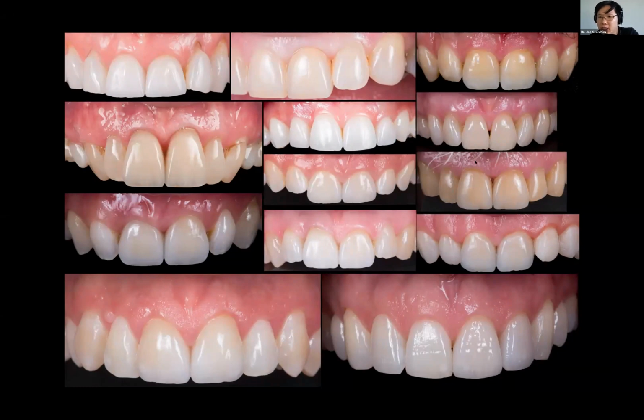The other thing, not particularly related to photography, is that when I do anterior cases, I always take a full arch impression because I want to give as much information as possible to the ceramist. If you have contralateral sides, they can look at the anatomy on the opposite side and copy that onto the other side. So for anterior cases, I almost always do a full arch impression. I don't do a triple tray impression for anterior cases.